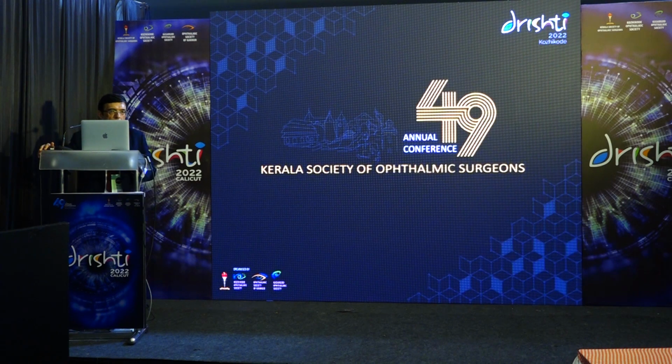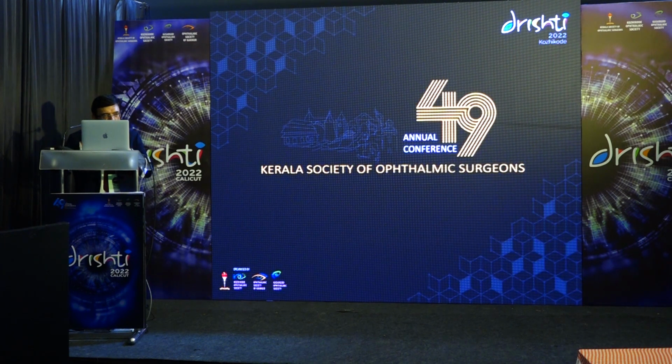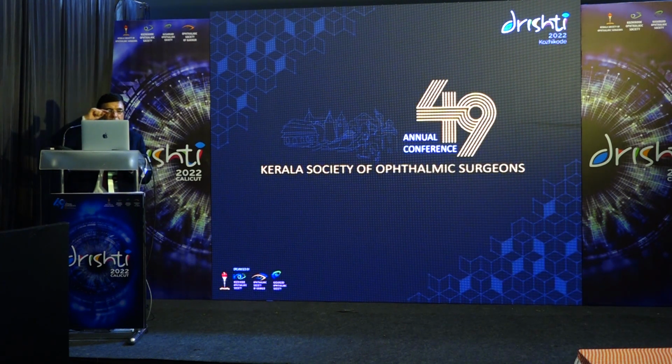Micropulse laser means Nd:YAG or something else? No, so micropulse laser we have 577 nanometers. It is a laser which delivers an on time and an off time. Supposing you are giving a pulse of 200 milliseconds, and it is a 5% duty cycle, then the pulse is on for 10 milliseconds and it is off for 190 milliseconds. The concept is that in that area, there is a recovery phase for the RPE so that it actually is a non-damaging laser and it can be done transfoveally. So you can go right through the fovea without damaging the fovea and it works fairly well.